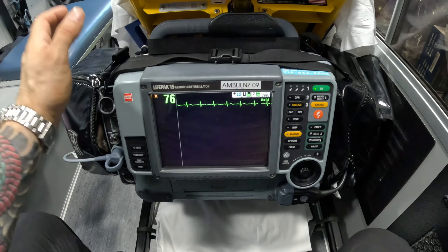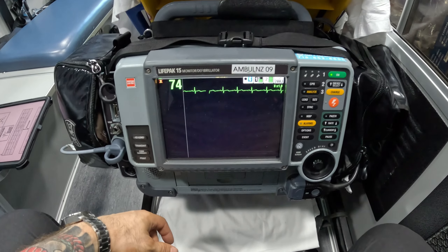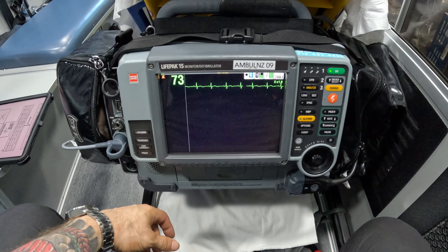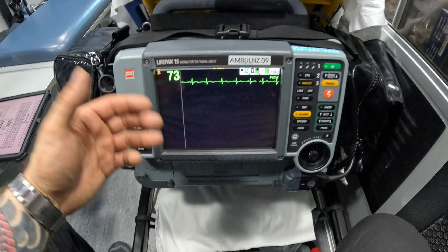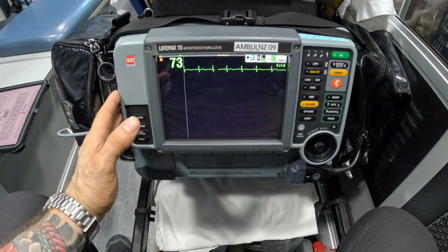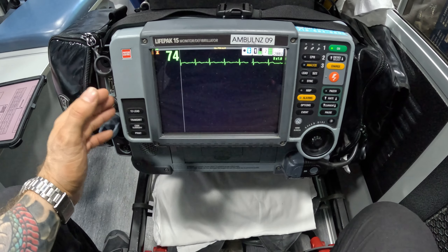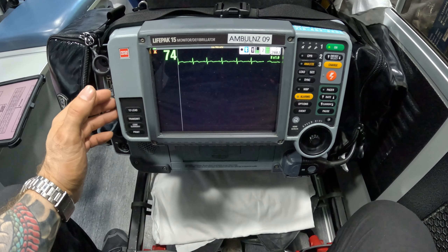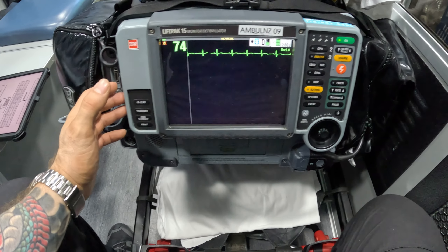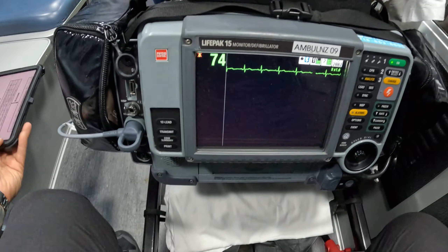So I have my partner, he's sitting right now on the stretcher, he has a 12-lead connected. We have not run a standard 12-lead, so we're going to do the standard 12-lead and once the monitor acquires it, it's going to look at the lead that has the most deviation on the ST segment.